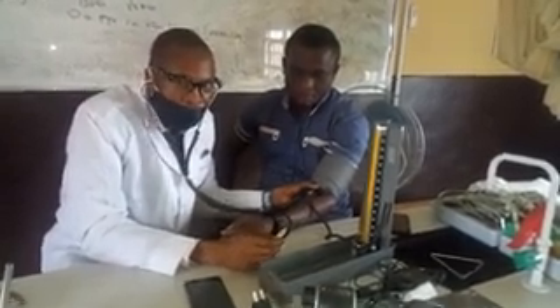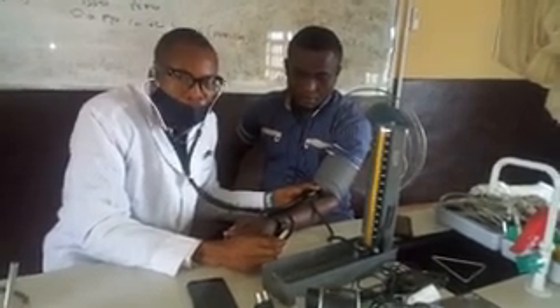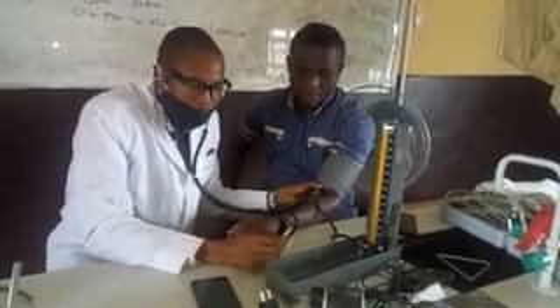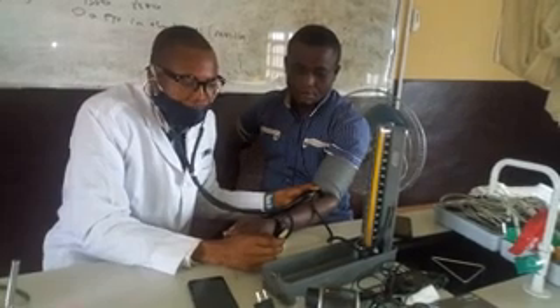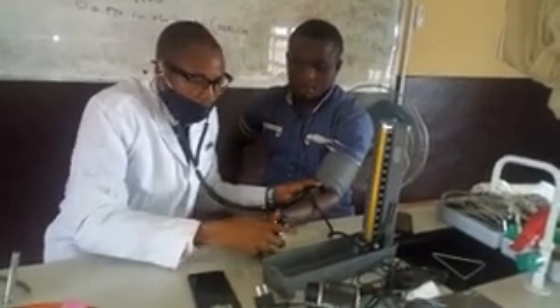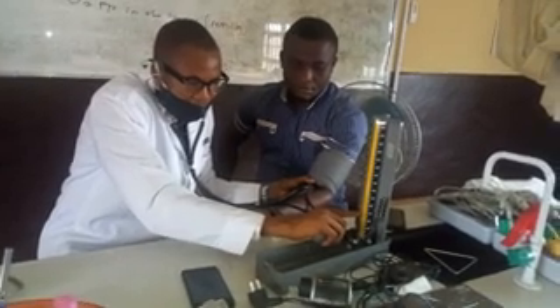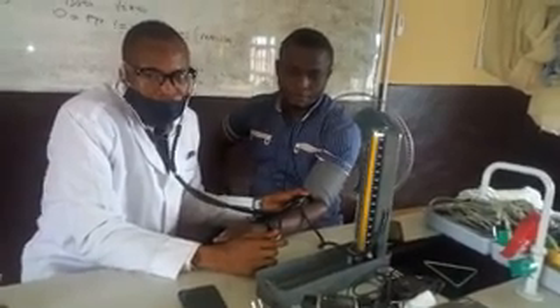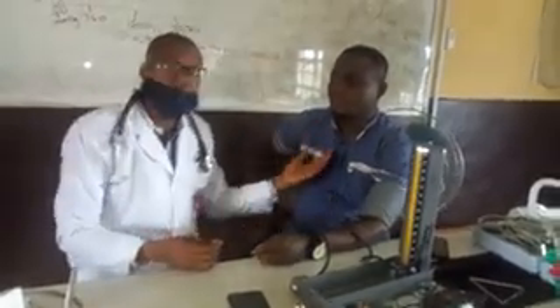You continue deflating — you hear the lub-dub sound, which represents the systolic blood pressure phase. Continue deflating until the sound disappears. Note the calibration at which the sound disappears — in this case it was 70 — and that becomes the diastolic blood pressure. So from this subject, the arterial blood pressure was 110 over 70, which is within normal range.